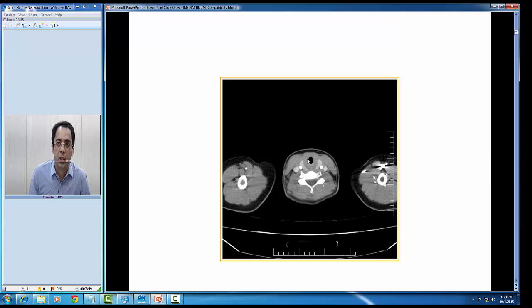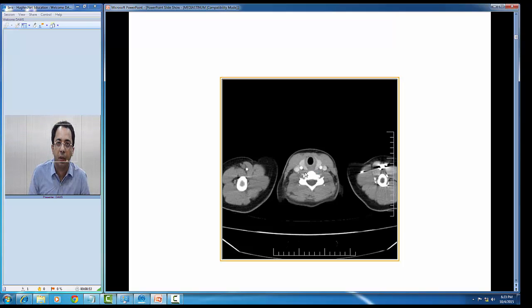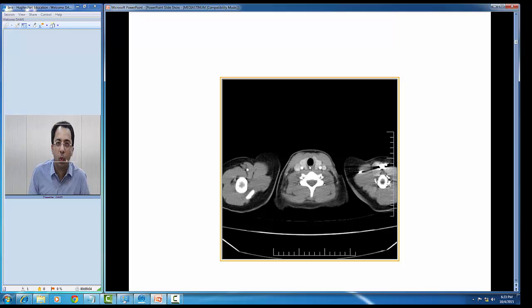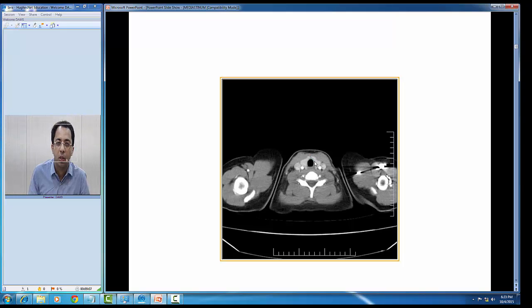You are able to see a hyperdense structure appearing here, and this central air-filled column is the trachea. You are able to appreciate the thyroid gland here. Because of the iodine content, the thyroid gland appears hyperdense on a CT scan. Going down, you can now see the thyroid isthmus, the right lobe and left lobe of the thyroid.